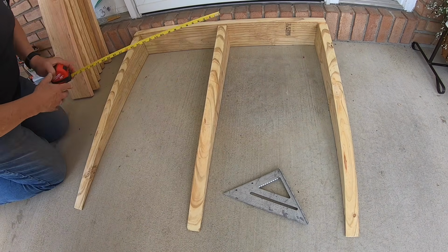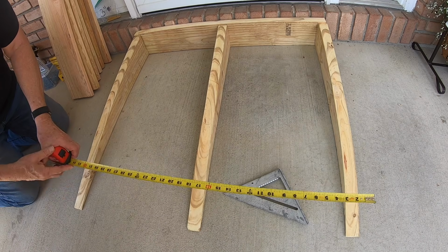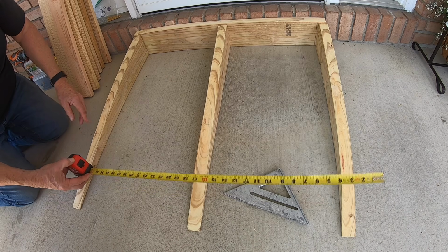So the next thing you're going to do is go ahead and measure. Remember, that is 36 inches up top, and down at the bottom should also be 36 inches right on the dot. And if it's not, you do want to go ahead and pull it out or push it in to make sure it is 36 inches.